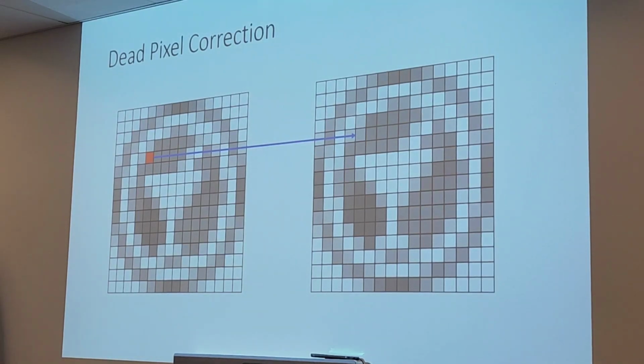What would a dead pixel actually look like? Does no one know? A dead pixel would look white, pure white, because a dead pixel means it isn't collecting X-rays, and if there are no X-rays, it looks white.